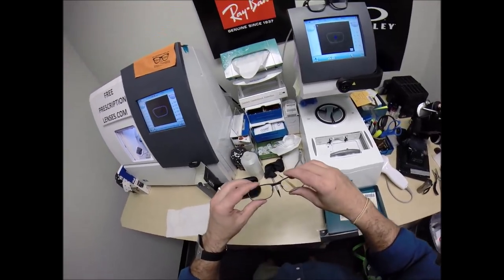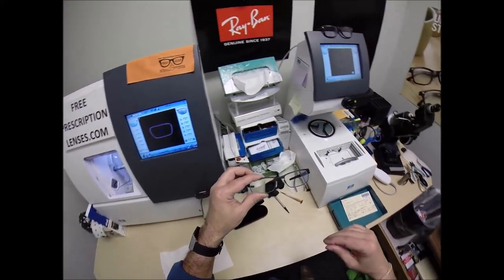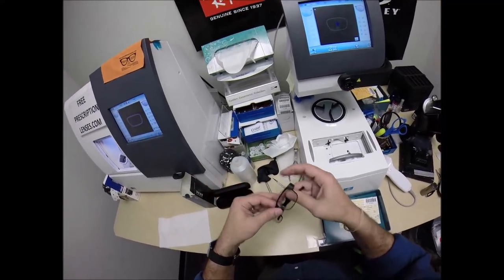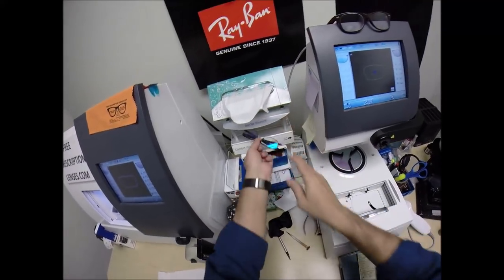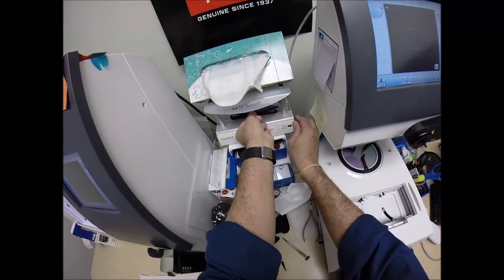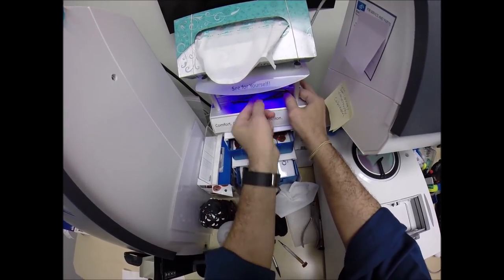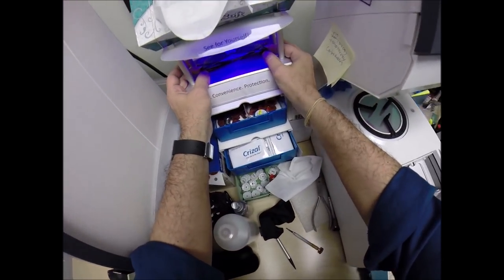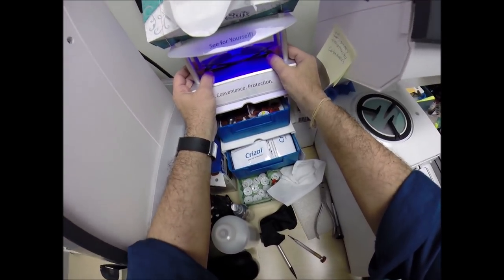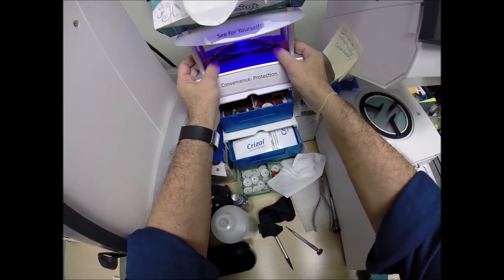So again, this is what your lenses look like clear. I'm going to go ahead and expose them to a strong burst of ultraviolet light in my little transitions box. As you can see, it takes about 30 to 45 seconds for transition lenses to darken. It takes a little bit longer when you come back inside, 45 seconds to a minute to a minute 15.